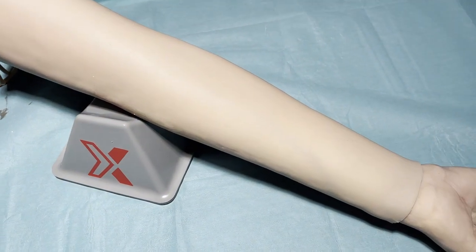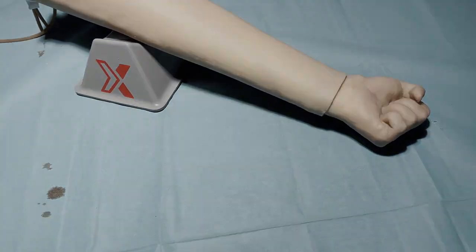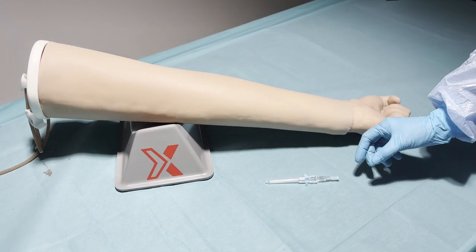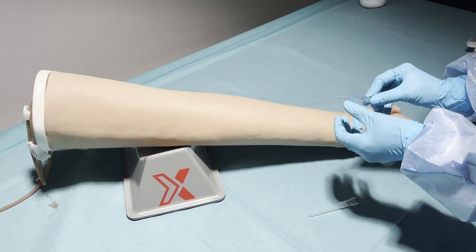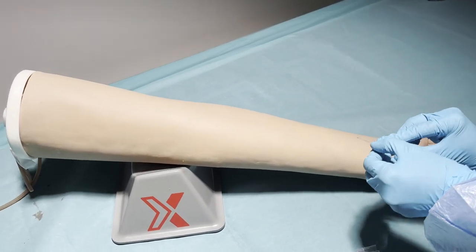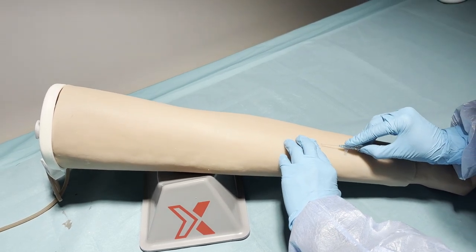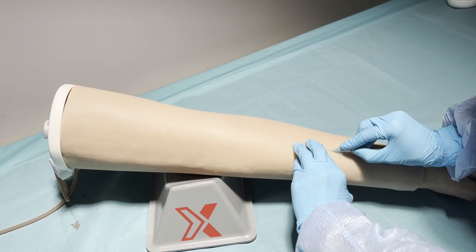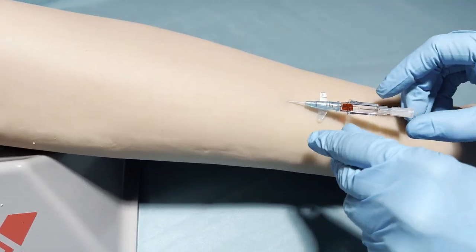You can also see that there is no leakage and the skin seals itself. You can also place a catheter in the IV arm. Make sure that we find the vein, insert the catheter, and you can see that there is blood there as well.